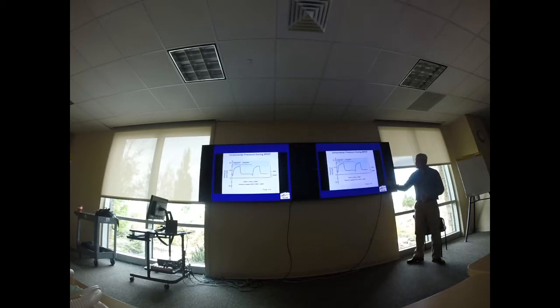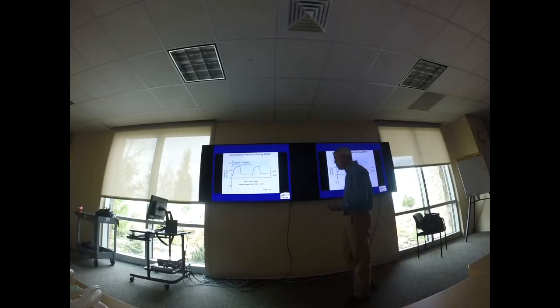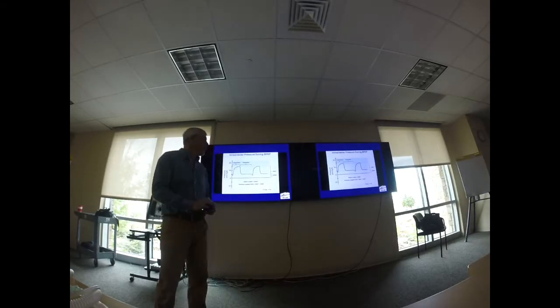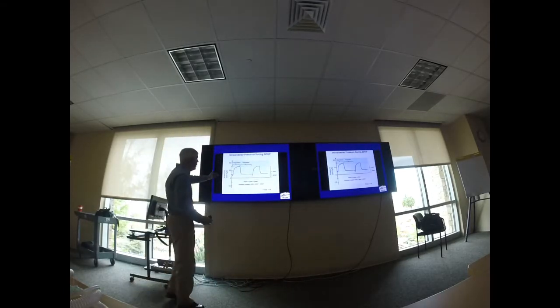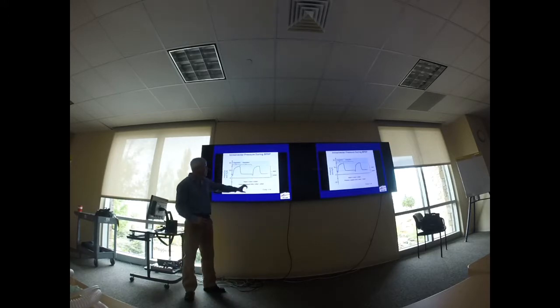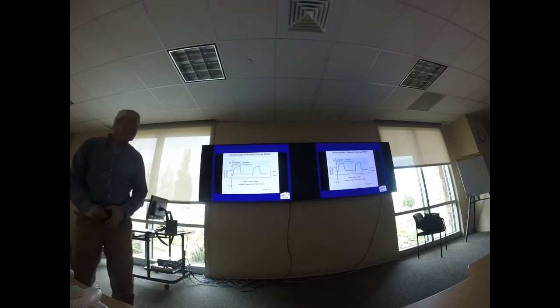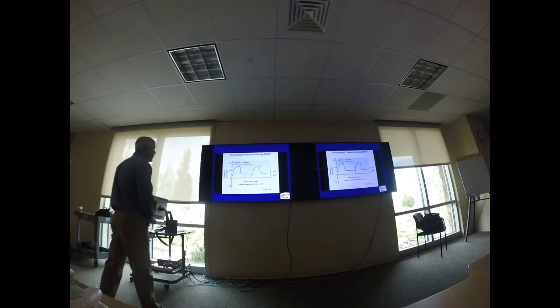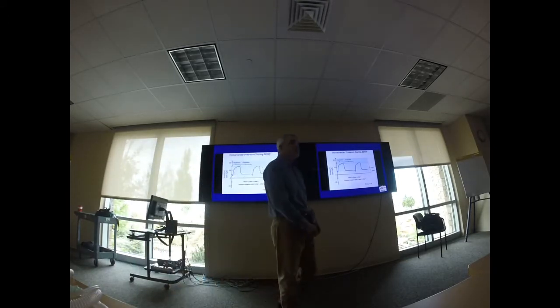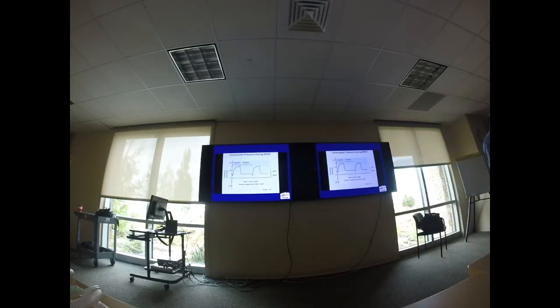BPAP has two distinct pressures associated with it. It has an inspiratory pressure and an expiratory pressure, an IPAP and an EPAP. And you guys can see right here, I've got my EPAP and my IPAP. My tidal volume is the difference between the two. My EPAP is very similar to continuous positive airway pressure. All right, so it's going to do pretty much the same effects.